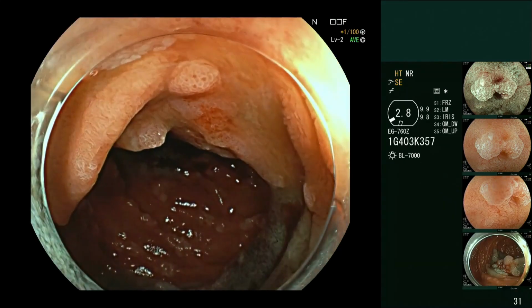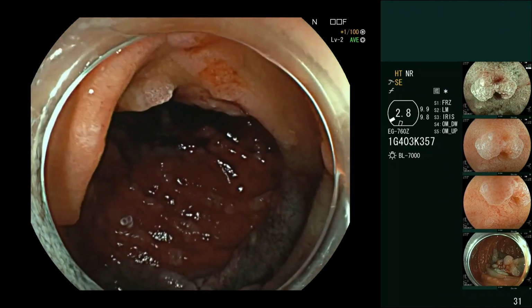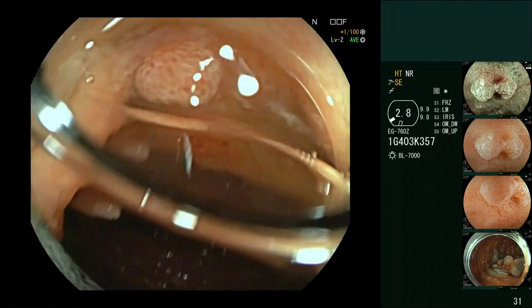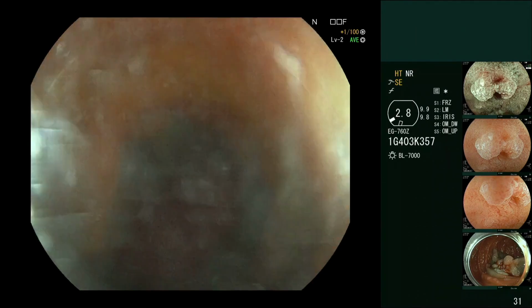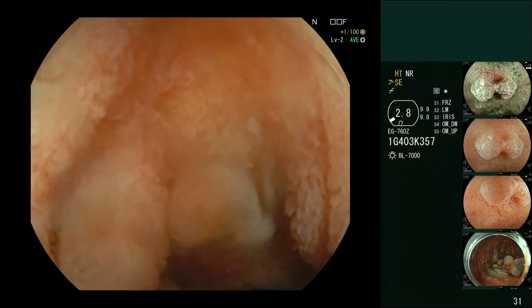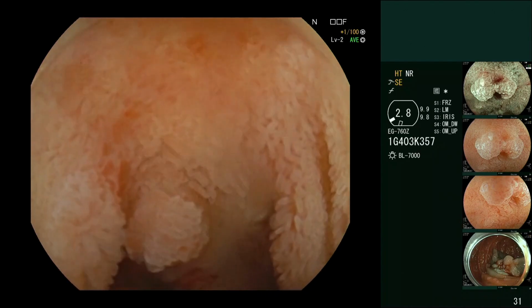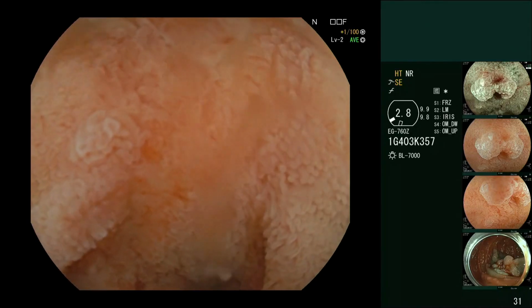So that is what a scar looks like in the duodenum, not like the colon. They're much different, as in they don't have that pale appearance that the ones in the colon have. And then as you're coming back here, right, we can't get in here. So what can we do? What techniques can we do? Well, we're quite insufflated in the lumen, so we can desufflate a little bit, maybe. And then we can just investigate this zone maybe with water to get onto that area, because I don't think we saw the orifice yet. And as we're using water, maybe it's possible to get in here, maybe not. Because I think that it's up here.